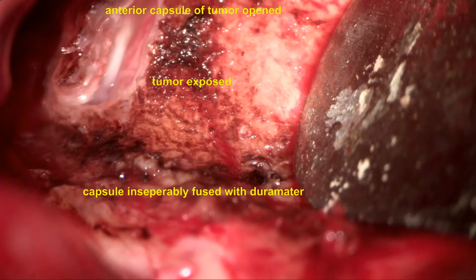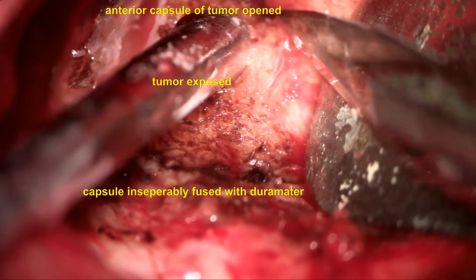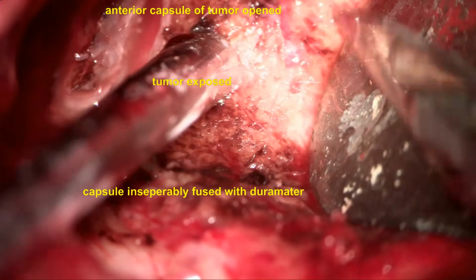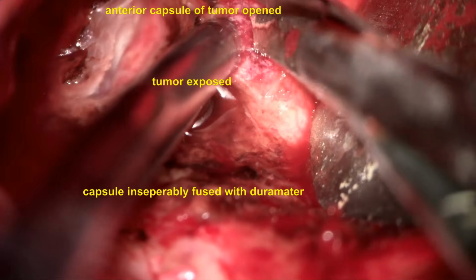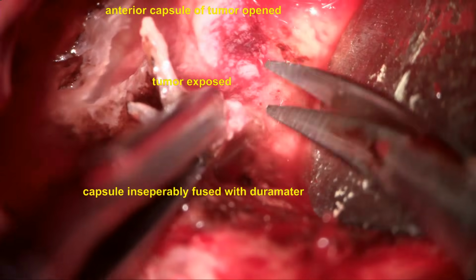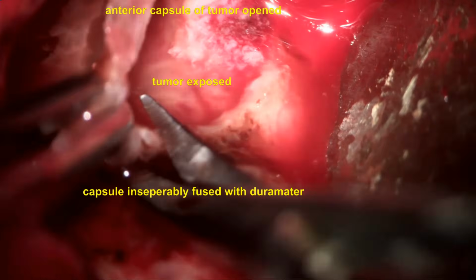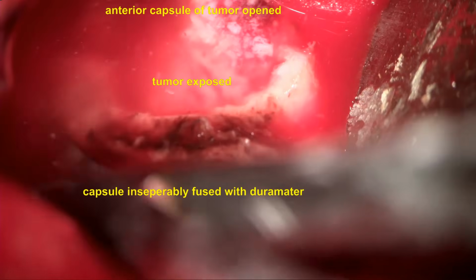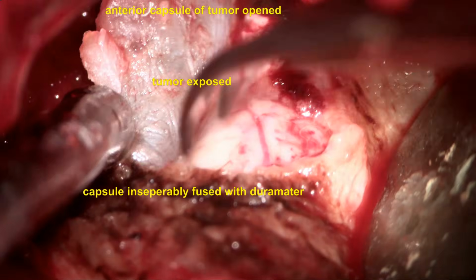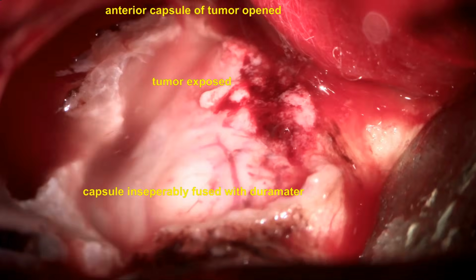Once that is done, the dura mater and capsule are opened quite wide, and the anterior part of the tumor is accessed here. Now you can see the basal anterior capsule adherent to the dura mater, which cannot be separated, is taken out, and the anterior part of the tumor is exposed very well.